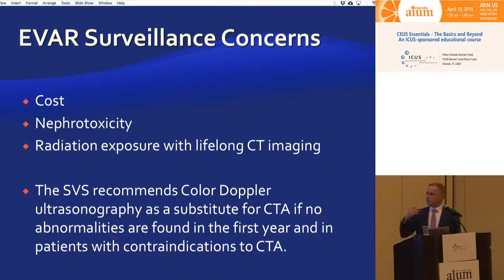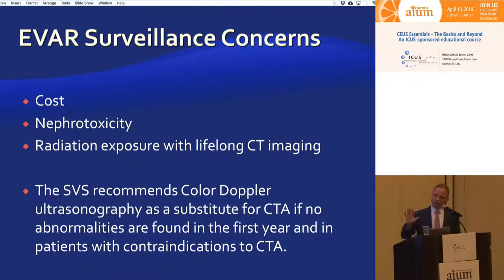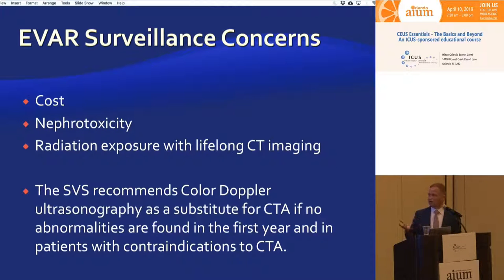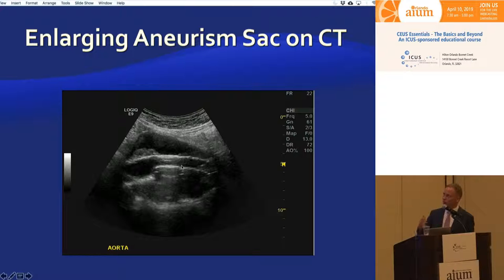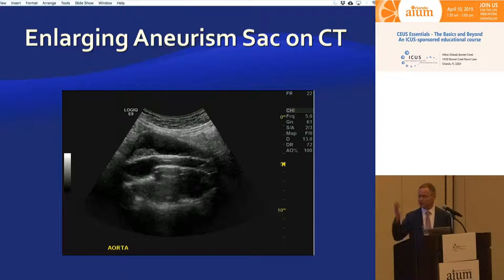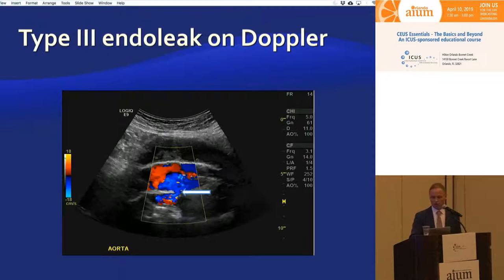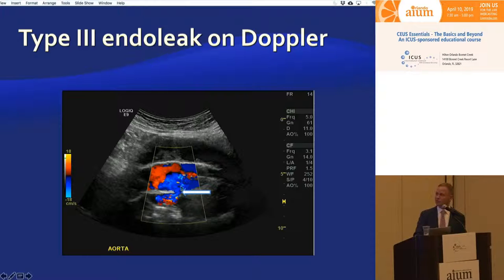Patients undergoing surveillance face contrast toxicity and radiation exposure from CT and MRI, so there is growing interest in using contrast-enhanced ultrasound instead. Color Doppler is just not sensitive enough. Example: a large aortic aneurysm with a stent and slowly enlarging sac on CT — CT and angiography were negative, but color Doppler at an outside institution showed a convincing leak at the junction between graft components, labeled as Type 3 endoleak, and the patient came to us for treatment.